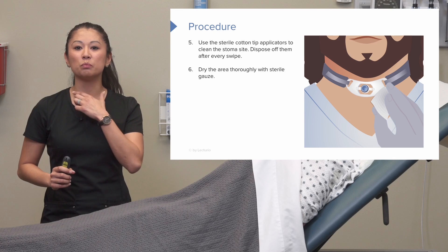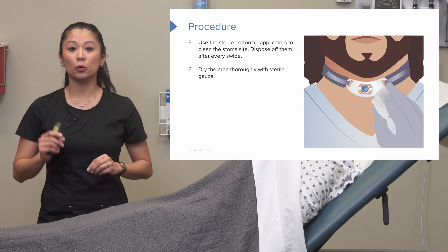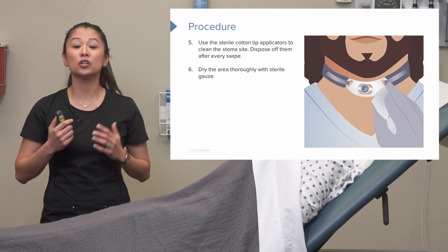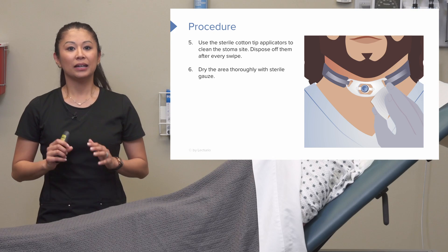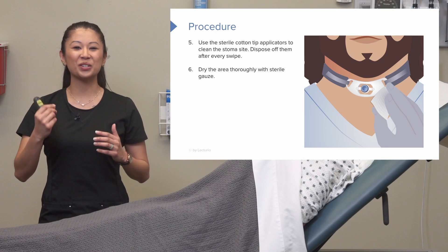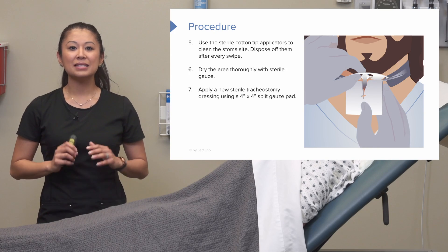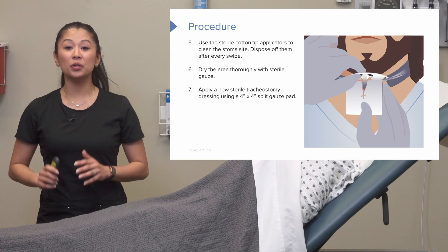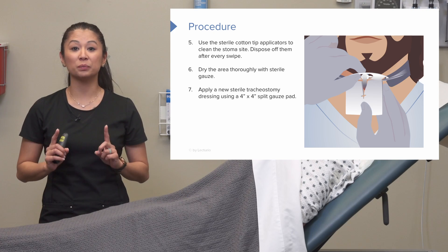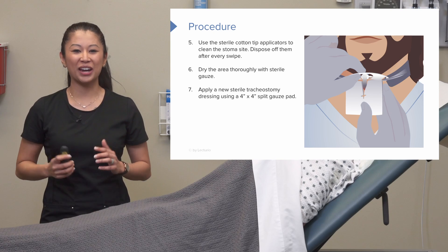We don't want to leave excess moisture underneath there, so we want to take our sterile gauze and dab and dry that site thoroughly. It's important that we don't scrub the skin — be gentle and pat here. Then go ahead and apply the new sterile tracheostomy dressing, that 4x4 split gauze pad, around the patient's trach.